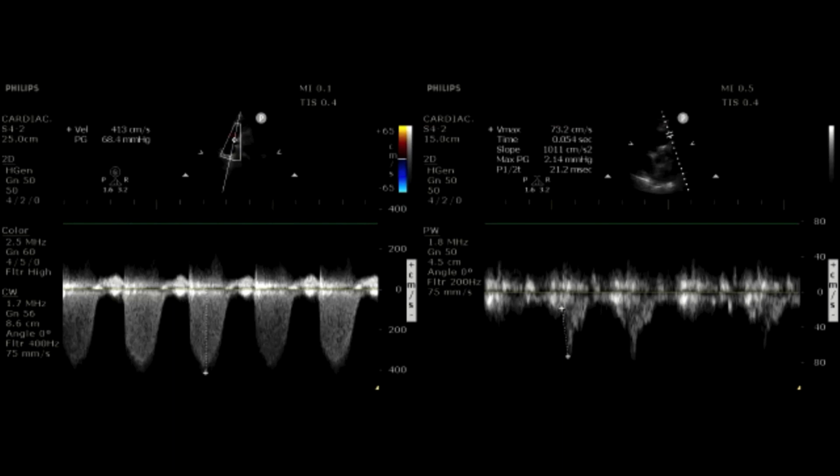So the timing of the notch is determined by the location and the severity of non-compliance in the pulmonary arterial tree. So if the location of the obstruction is quite proximal, as would occur in the main PA, or the proximal main segments of the pulmonary, the right and left pulmonary arteries, the reflection wave occurs quite rapidly. So you will see a notch that is almost like a spike and dome. If you read that paper, it's very well described. So the spike has this short duration, and then the dome has a much longer duration because the obstruction occurs during the earlier part of the cardiac cycle.